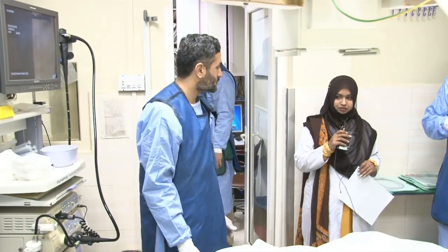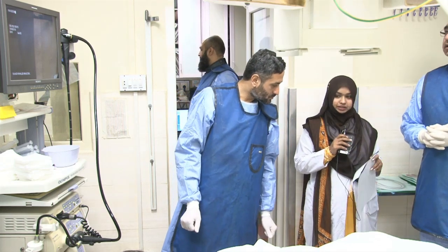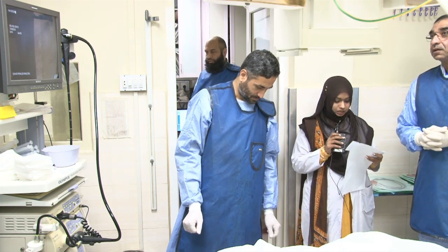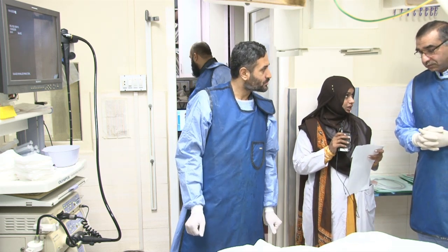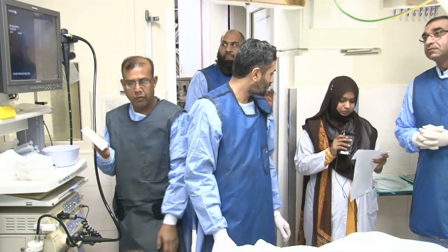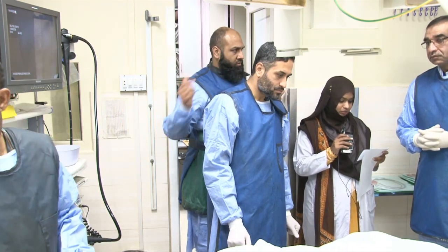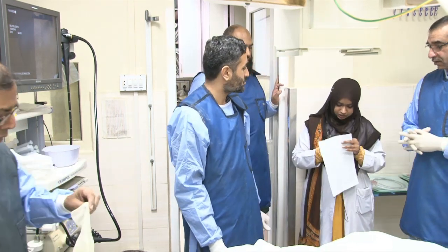Okay, she is a 55-year-old lady, known case of diabetes mellitus and hypertension, and she presented to us with complaint of right hypochondrial pain for about 1.5 months. Her abdominal examination is normal. Her LFTs are total bilirubin of 0.78 and alkaline phosphatase of 193, that is raised. Ultrasound abdomen showed dilated intrahepatic ducts with gallbladder stones and a dilated CBD of 7.4 millimeter with a calculus in the CBD. Right, okay, fine. I should say for ERCP.